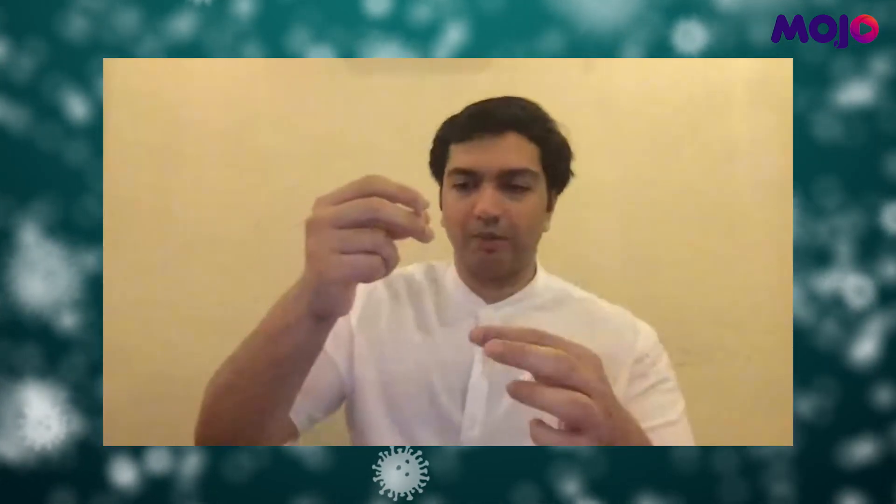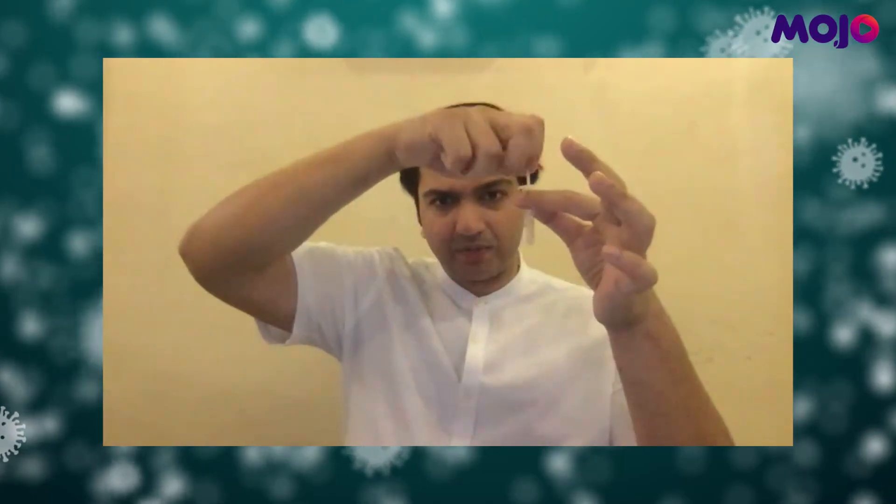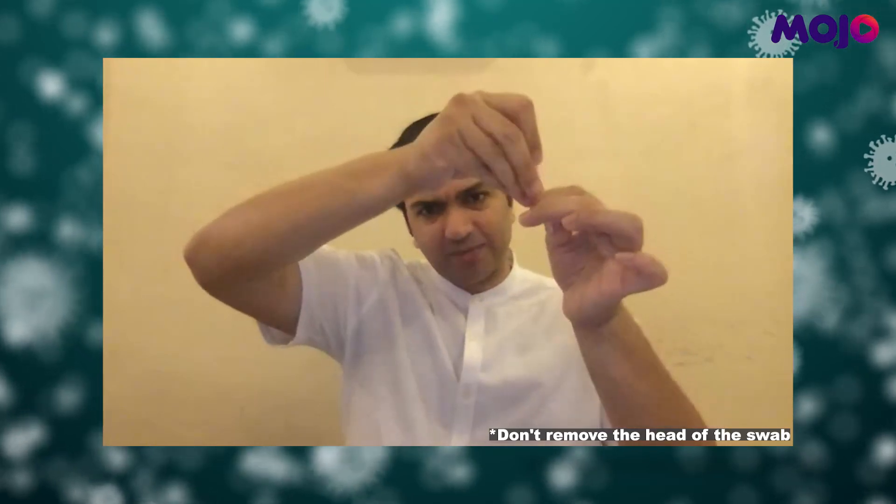Just to show you what I'm doing: I'm going to put the swab in and rotate it 10 times. Now I'm going to remove all the liquid from the swab by squeezing the plastic as I pull the swab out.